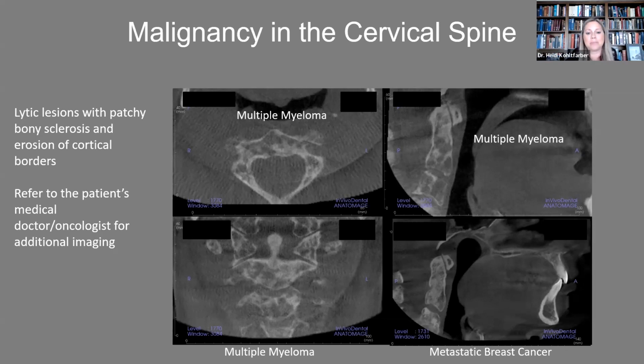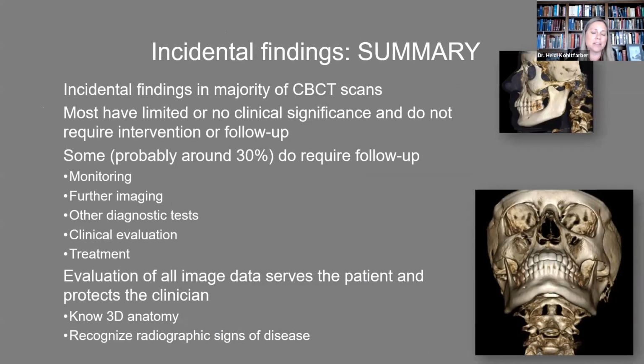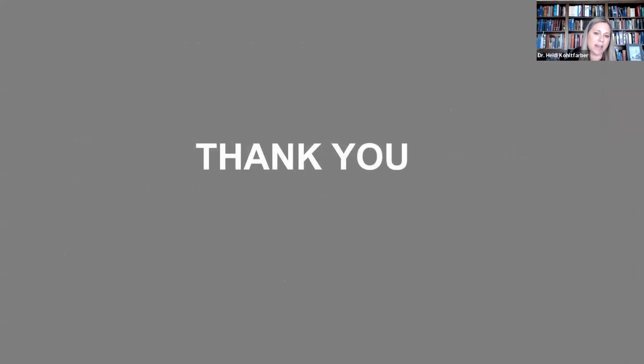Anyway, all right. Well, thank you guys so much. In summary, we see a lot of things with our CBCT. It is an amazing, amazing technology. Definitely we could do a part 2 of this because we see so much stuff. It'd be fun to share some more of our interesting and fun cases with you. And yeah, are there any questions? And again, when in doubt, you can always refer.